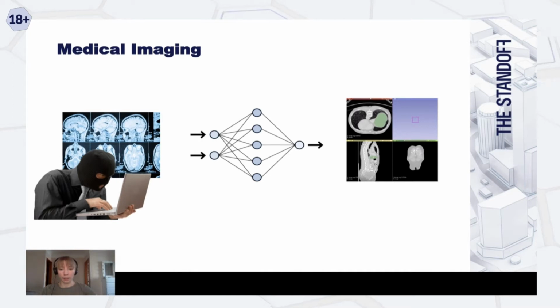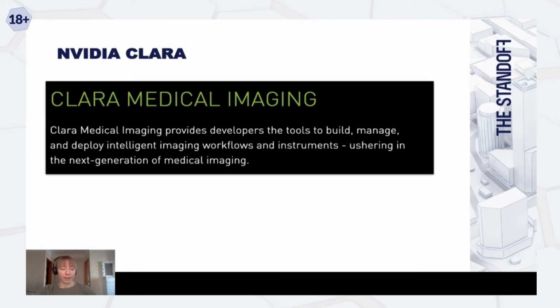Knowing the vulnerabilities in the DICOM protocol, he would send wrong files on purpose, and after a while, this network will start giving out wrong data. It will start saying that a person suffering from COVID is not infectious and contagious, and the contagious person will walk the streets infecting other people.